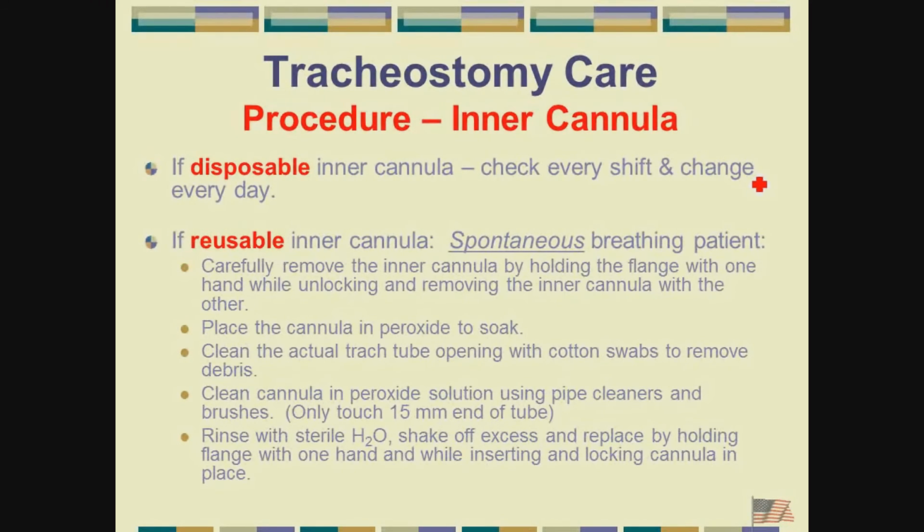We're doing a spontaneously breathing patient who's on a trach mask. So you're holding the flange with what, because the non-sterile is unscrewing it? So what are you holding the flange with? Where's your third hand? We'll show you when we demo it, you actually are holding the flange with the fingers and turning it with your thumb and finger. It can be done.